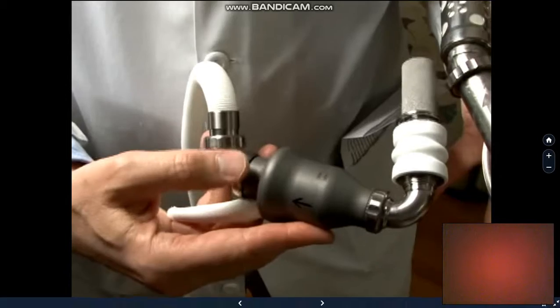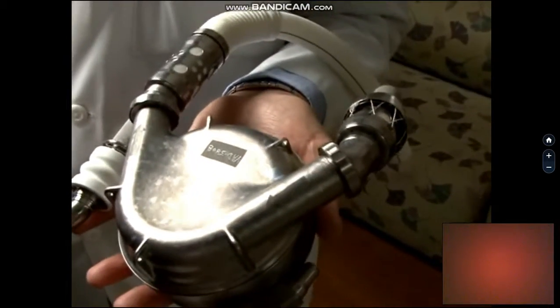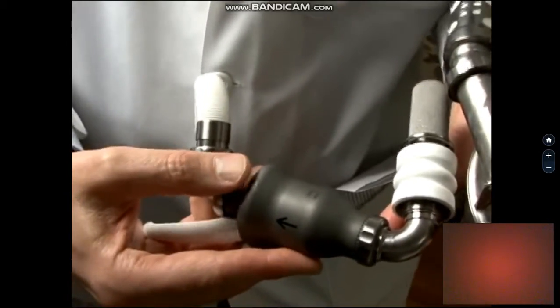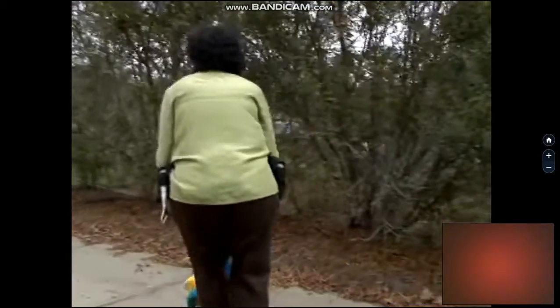Although heart pumps have been around for years, the new continuous flow pump, called the HeartMate 2, is about 1/7 the size of the more commonly used pulsatile flow pump. The smaller size of the continuous flow pump allows patients like Leonore to get around more easily. In Leonore's case, spending quality time outside with her kids.